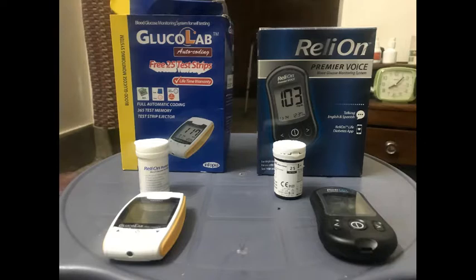This is a comparison video between two blood glucose monitors. The one on the right is ReliOn, which I got from Walmart in the United States, and the one on the left is Glucolab, which I got here in Pakistan. They're both very reasonably priced, low-end meters. The ReliOn I think I got for $14, and the Glucolab for about 2,000 rupees, which is around $20, and I think it did come with the test strips.